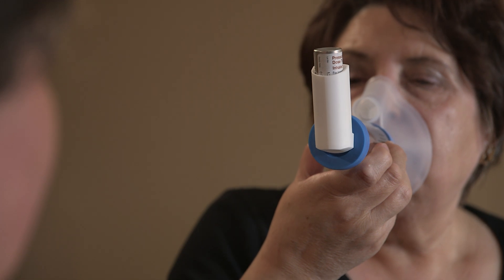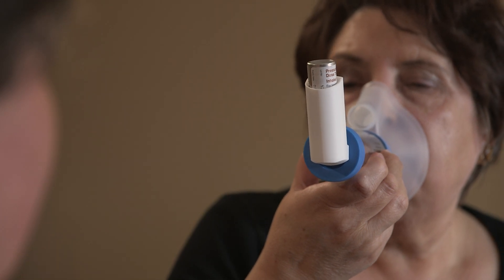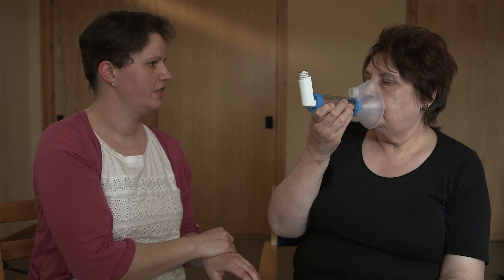So let's take a deep breath in. One, two, three, four, five. That's you done. Thank you.